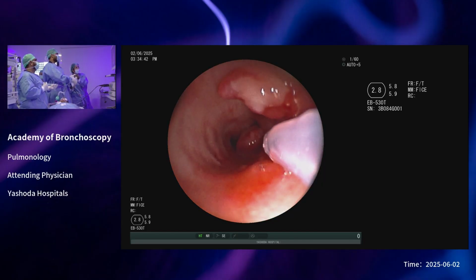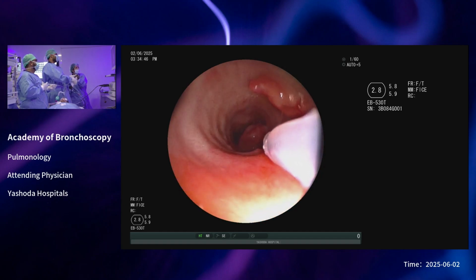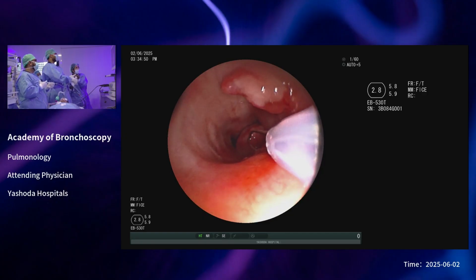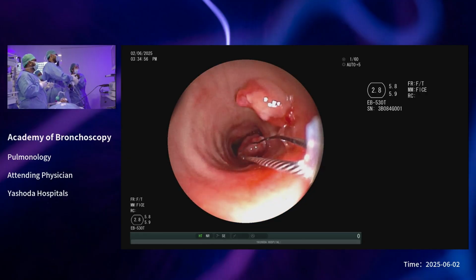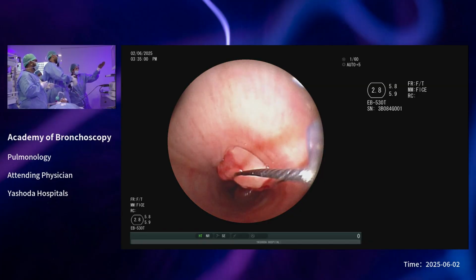Open. One minute. Yeah, try to open here and loop around. Open slowly. Pull the guide sheath a little back. Open a little more. Yeah, now you loop around slowly by turning and flexing. Now you turn slowly. Very good.